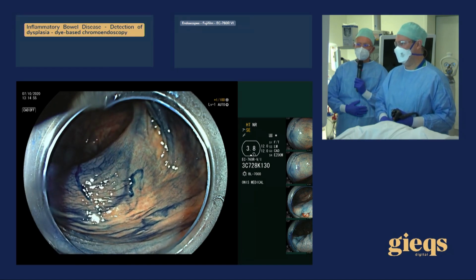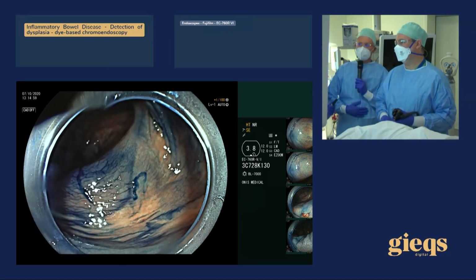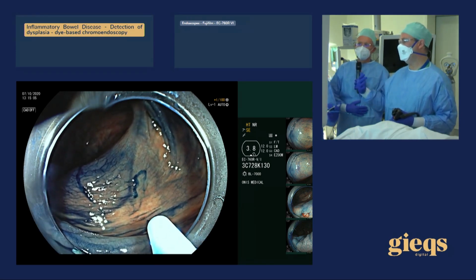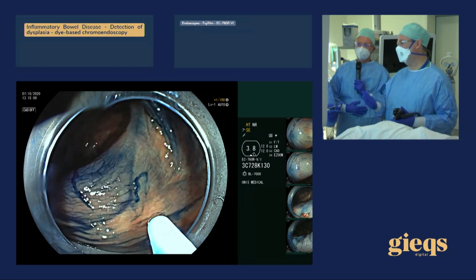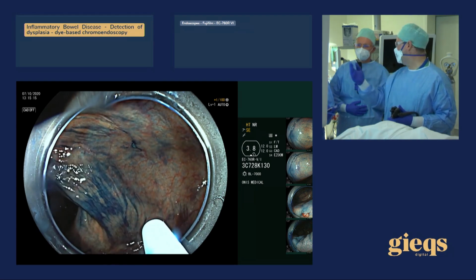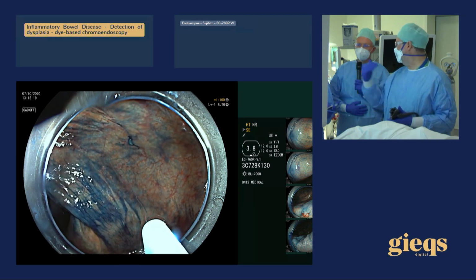Okay, great. And while we're finishing up, anything on formal training in chromoendoscopy? Yeah, we have just formulated that with ESGE. The goal is to go for 1 or 2 weeks to somebody who does this, to see a few cases, to get acquainted with the technique and everything. And then you just have to start, basically. So first do those 10, 20 cases with a backup of the random biopsies. Then do 20 cases and get feedback from the histology.